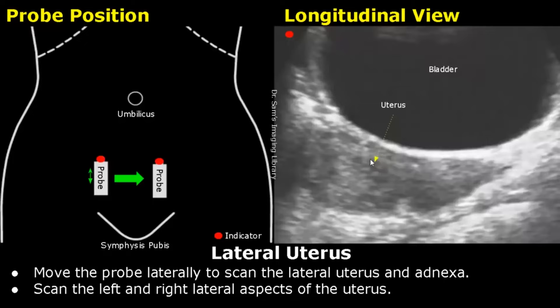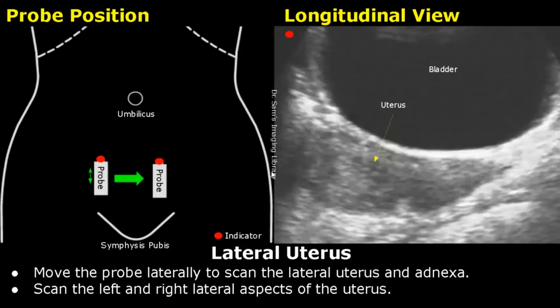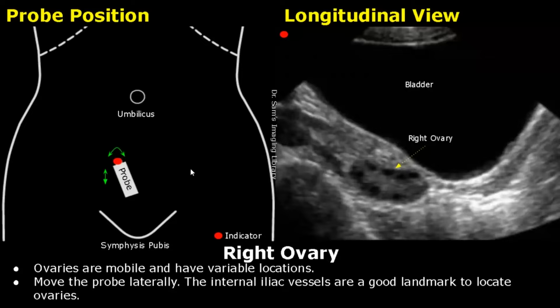To scan the lateral aspects of the uterus, move the probe laterally towards both the left and right sides. This is the lateral aspect of the uterus. We will now see how to scan the ovaries. The ovaries don't have a fixed position, but locating the internal iliac vessels is a good landmark to locate the ovaries.